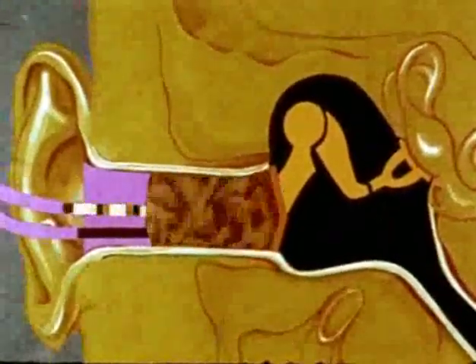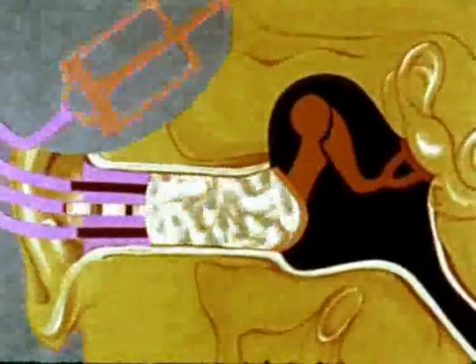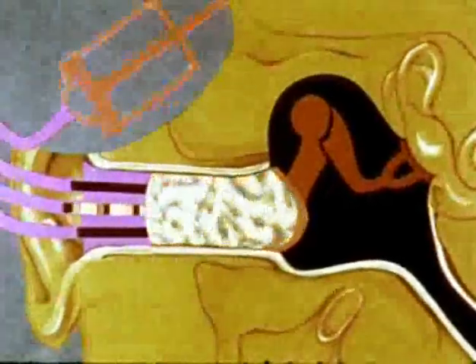Thirdly, the addition of a pump allows the air pressure in the external canal to be varied from that of the middle ear, thus clamping the tympanic membrane. Less sound will then be absorbed by the conducting mechanism, raising the acoustic impedance of the middle ear.